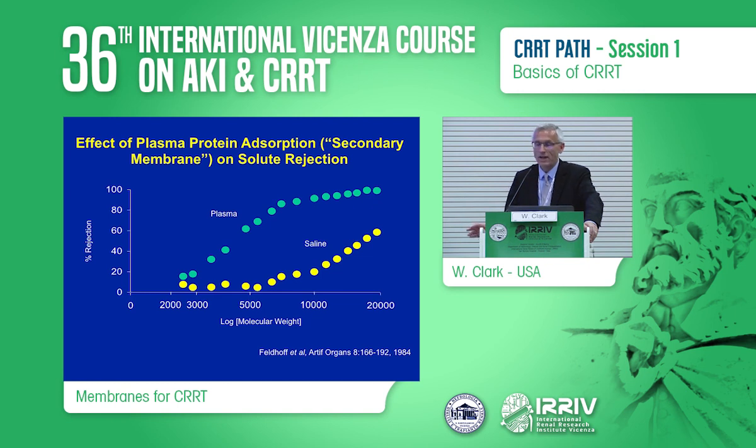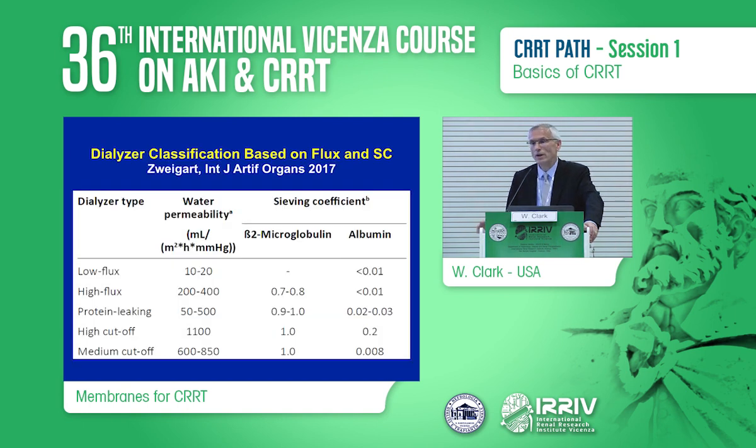So a substantial impact, and the impact relatively increases as a function of solute molecular weight, in a direct way.